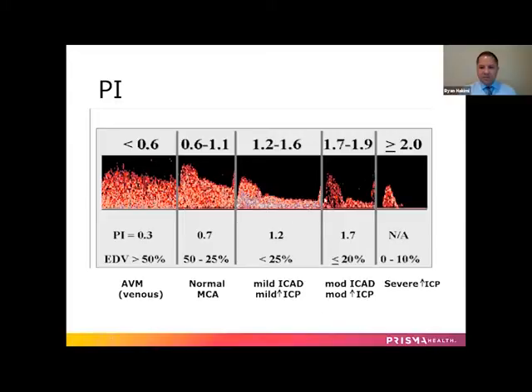And as you further go down, you see that the diastolic blood flow is impacted, and this is how many times when we talk about cerebral perfusion pressure, we all know that that is the MAP minus the ICP. This is a pictographic way of looking at that because the diastolic component is reduced, so therefore the cerebral perfusion is reduced, and it's primarily because in this example the patient has increased ICP.